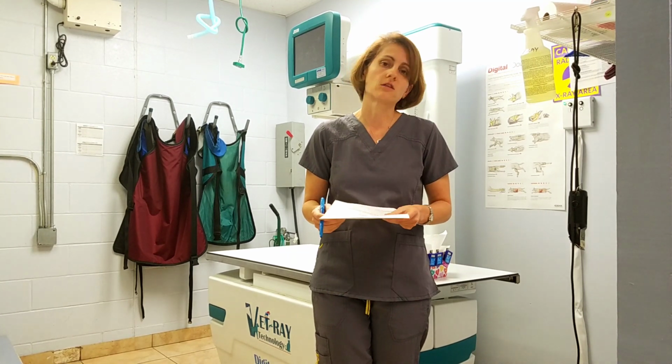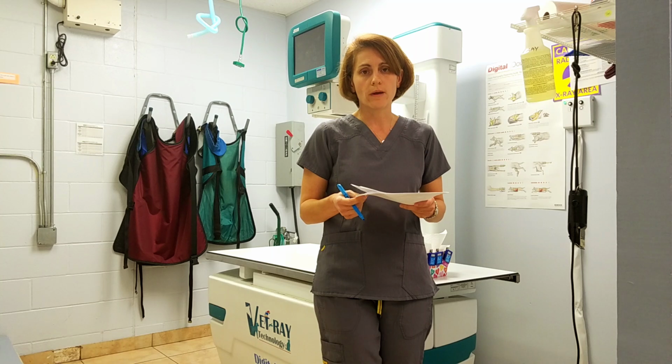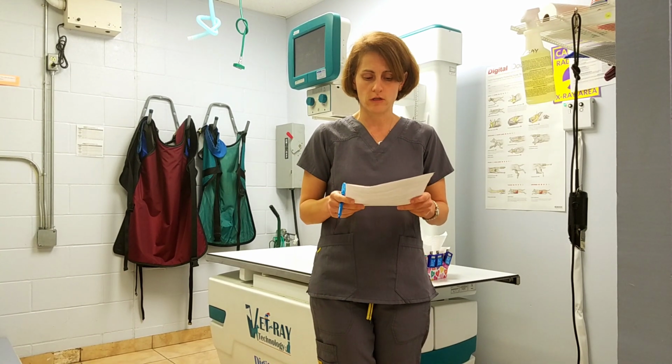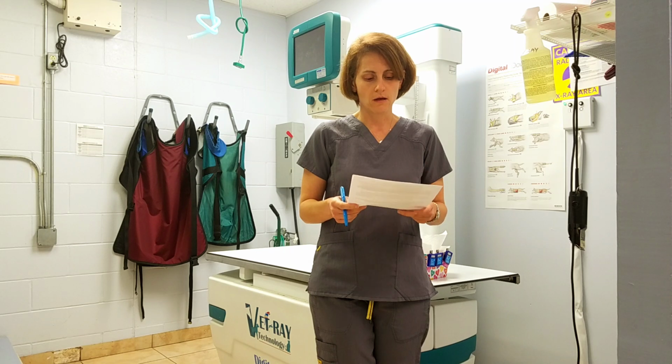If we're not able to get the shots that we need, again, let the vet know. We may need to sedate the animal, we may need to change something, but increasing your exposure is not what we should be doing.